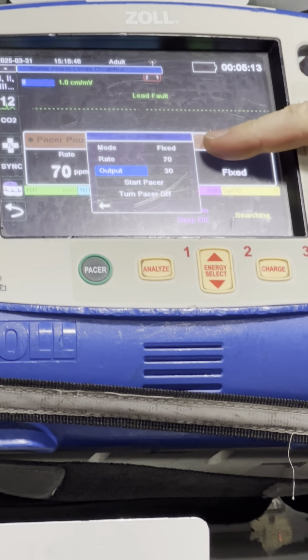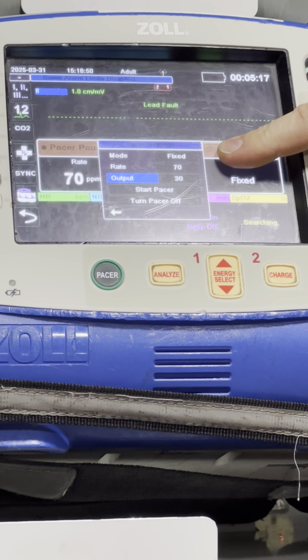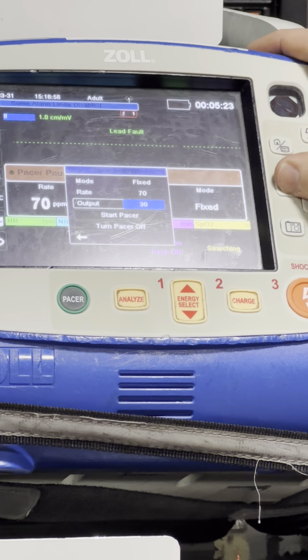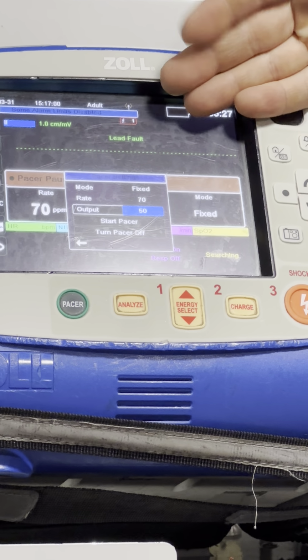Fixed pacing is the only pacing the protocol allows us to do. If it says demand, make sure it changes to fixed. A rate of 70 is a good starting point. The initial output is always 30 milliamps. We'll increase the energy until we see electrical capture.